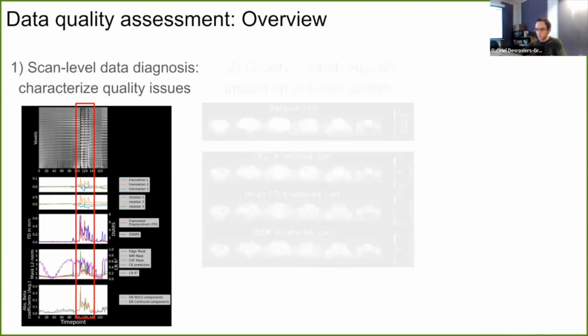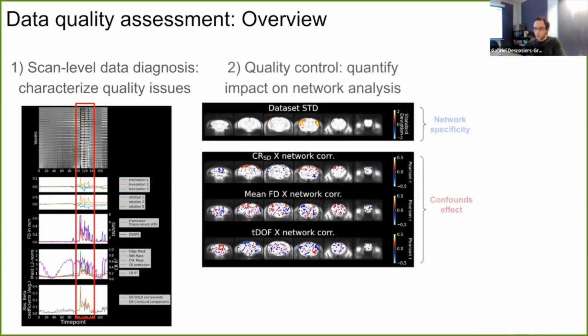and then try to infer what might be a good correction strategy or how they can impact your results. But then after this observational step, we need to more formally quantify how potential statistical analysis might be impacted by data quality issues. That's why there's a subsequent report, mostly at the group level, that aims to summarize how your data quality might be impacted, to really complement the observational nature of the first report.